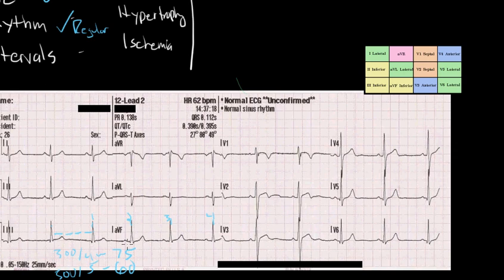Now when I'm looking at my rhythm, I always take a moment to make sure that I have P waves, because if I have P waves, that represents a sinus rhythm, because the P wave means that this is in fact coming from the SA node, and so I know here I have a regular sinus rhythm. If I didn't see a P wave, I'd be worried that there was some other rhythm involved. It's also important to make sure that P wave is associated with your QRS complex and not just occurring randomly, despite the rhythm of beats that you're seeing.